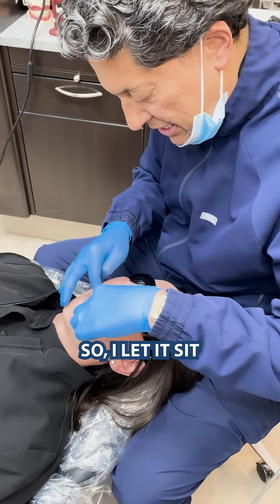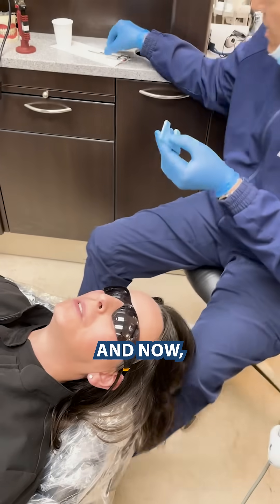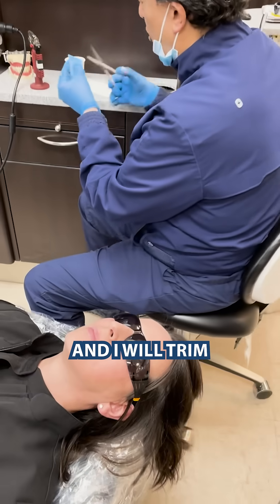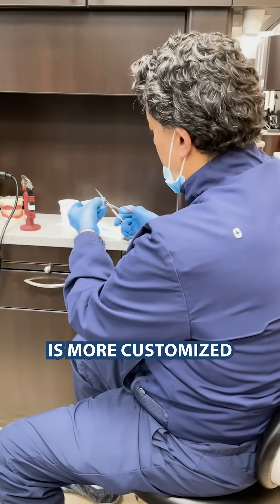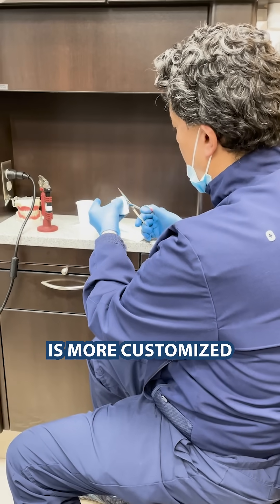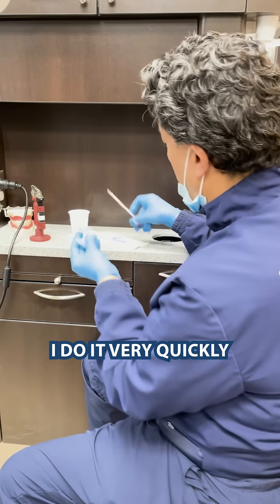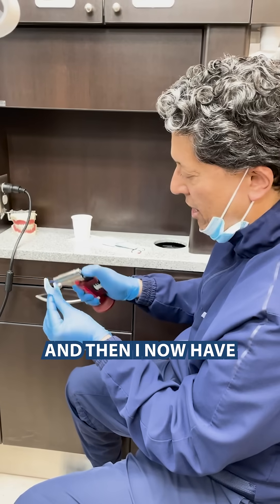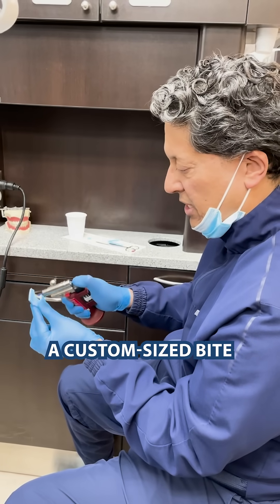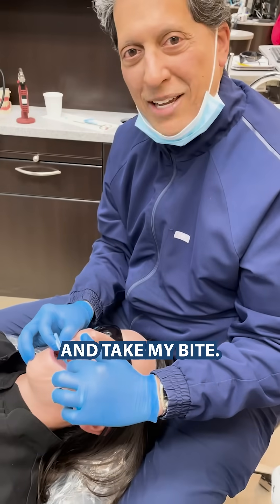I let it sit over the arch, take it out, and then trim that bite record so that it is more customized to the size of the patient. I do it very quickly with scissors, and now I have a custom-sized bite record ready to take my bite.